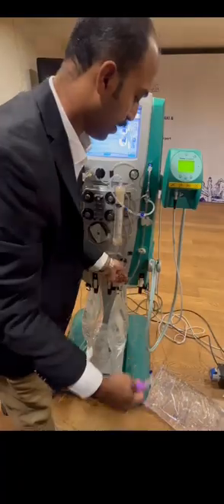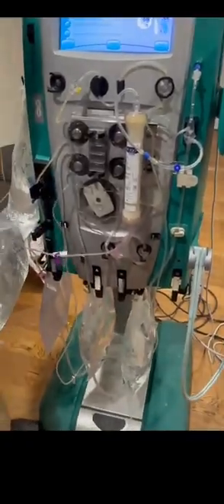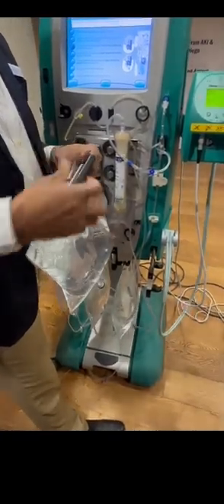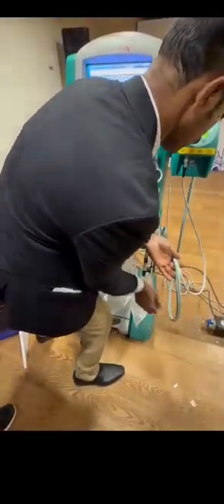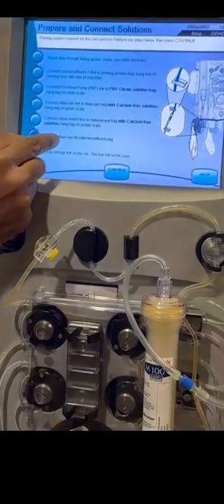Then in the post replacement also, we say you have to use Biphozyl only, but now I am using Prismaflex. I have to use calcium-free solution in the post replacement also. Usually dialysate and replacement are the same. Yes, Biphozyl. So now dialysate is connected, then replacement also connected. Now what is it saying, connect.